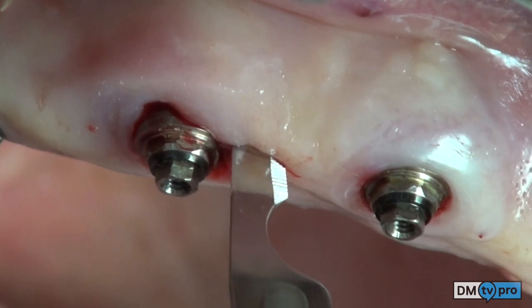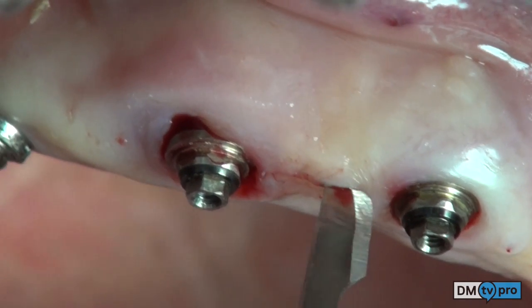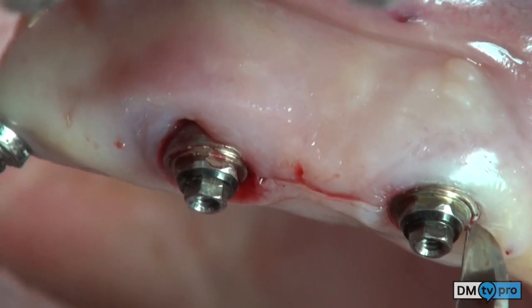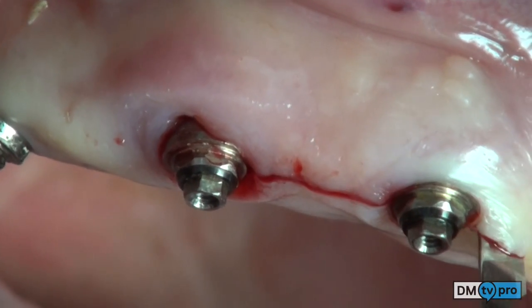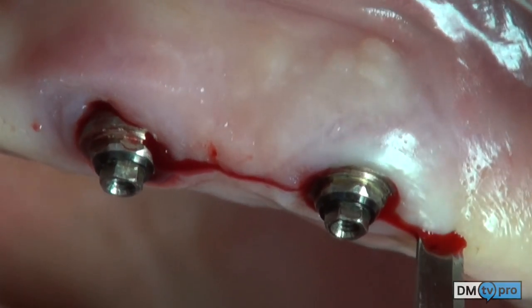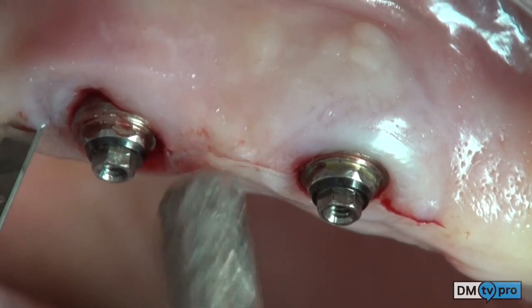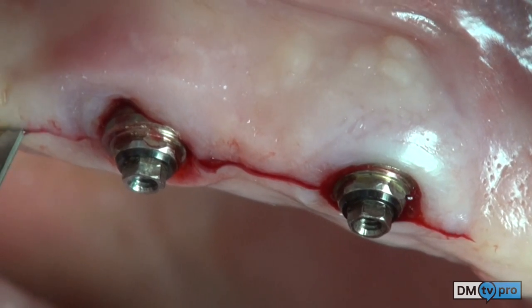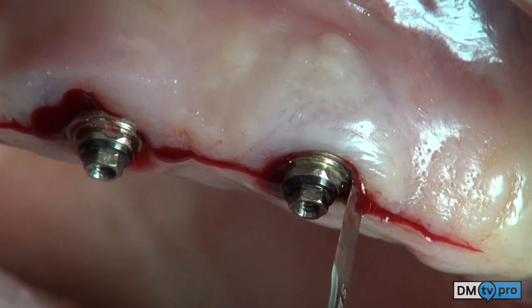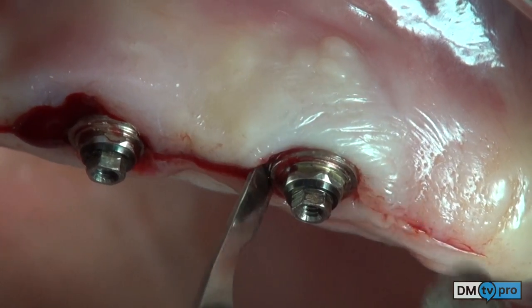A first crestal incision connecting the two neighboring implants is performed, then the crestal incision is carried out on the mesial and distal aspects. Intrasulcular incisions are performed around the two implants with an internal bevel that will remove a first portion of granulation tissue.